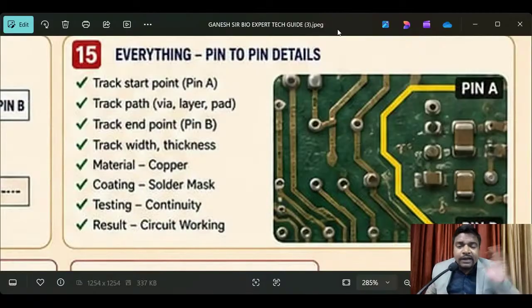Simply, outside, you replace the power cord also. Okay, fine. But still not resolved. Then you have to check the fuse. That is also fine. Next, you have to go to the board. What happened? The board actually needs 12 volt output, but the 12 volt is not being received, so it doesn't provide the result. Understand? When we provide the input load to the board, it takes it but doesn't release the required voltages. That is the reason the tracking is the issue. So tracking checking is very, very complicated and very difficult. Those are the next level.